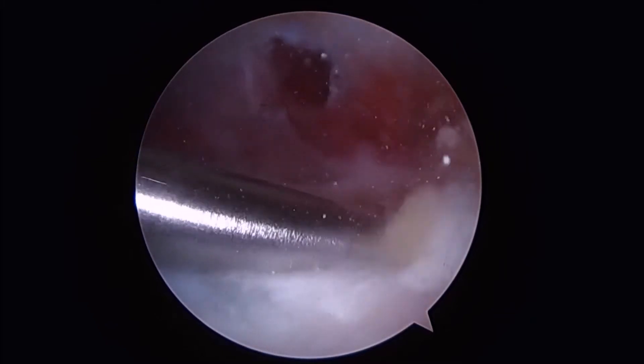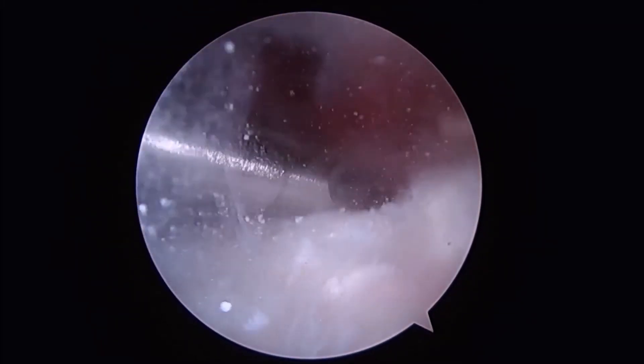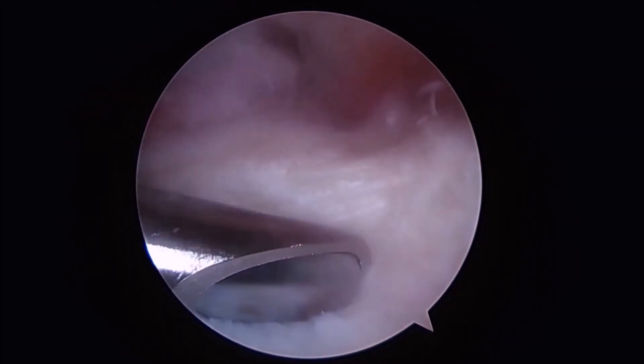The shaver is then reintroduced and we gently palpate the rotator cuff to milk out the remaining calcium. The shaver is then used to remove this from the subacromial space.